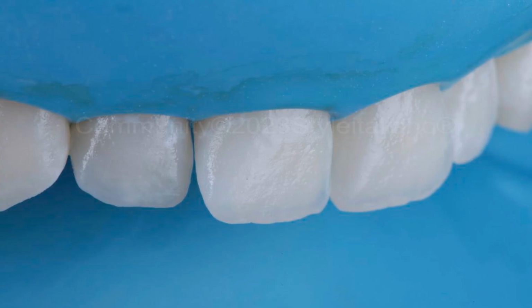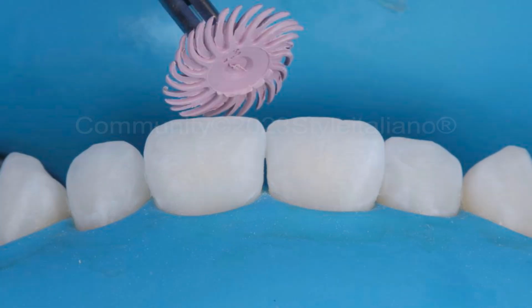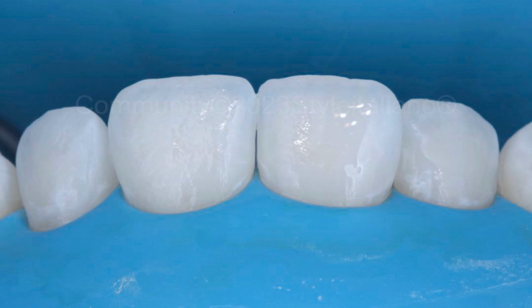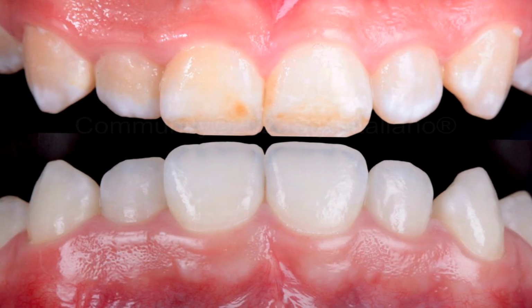The immediate post-operative pre-polishing result. Polishing protocol using medium and fine polishing spirals, another wheel, and we have a final high luster polish using glossy diamond paste. Immediate post-polishing high luster, immediate post-operative result. And this is the final result, pre and post-operative result.